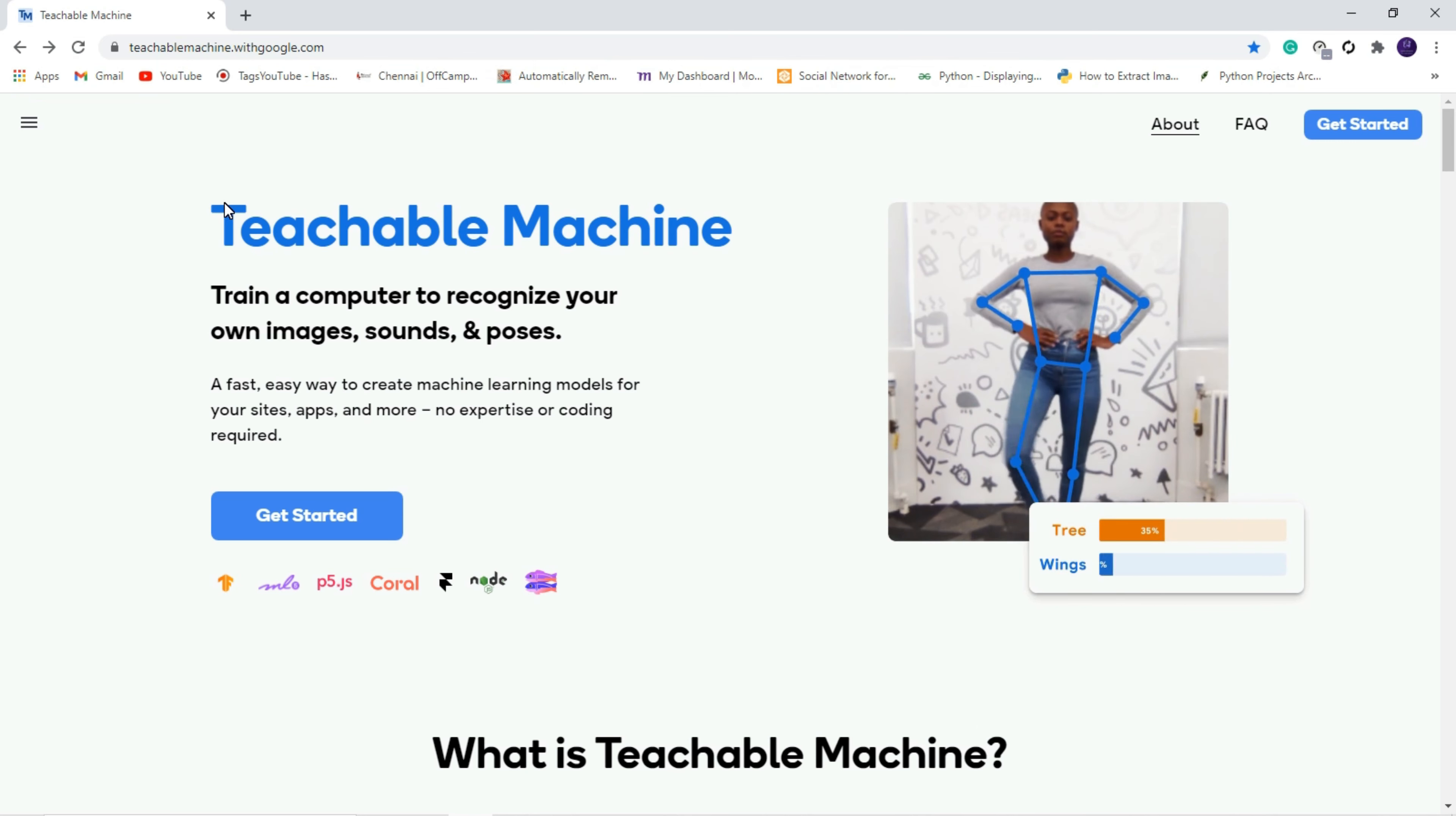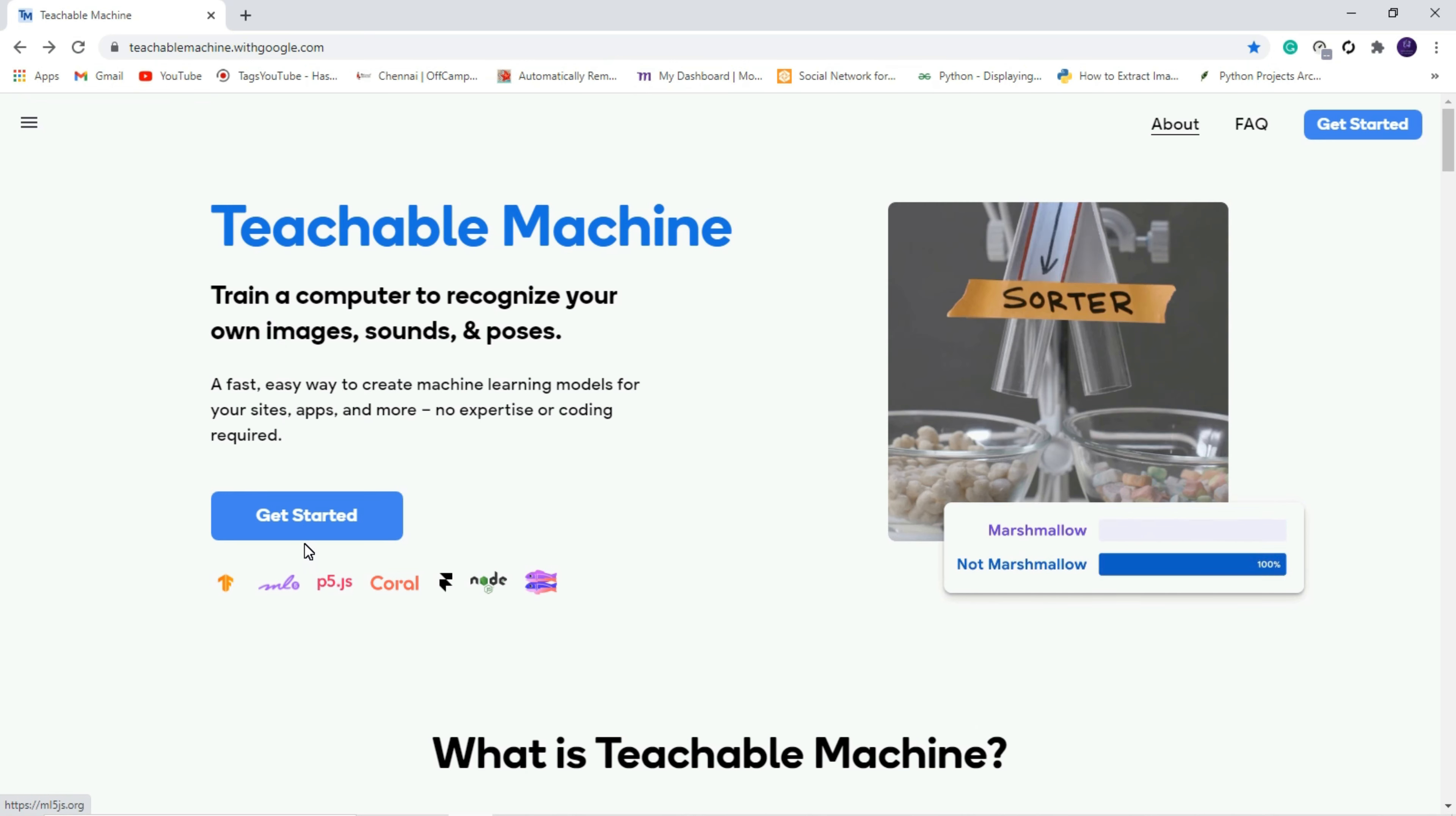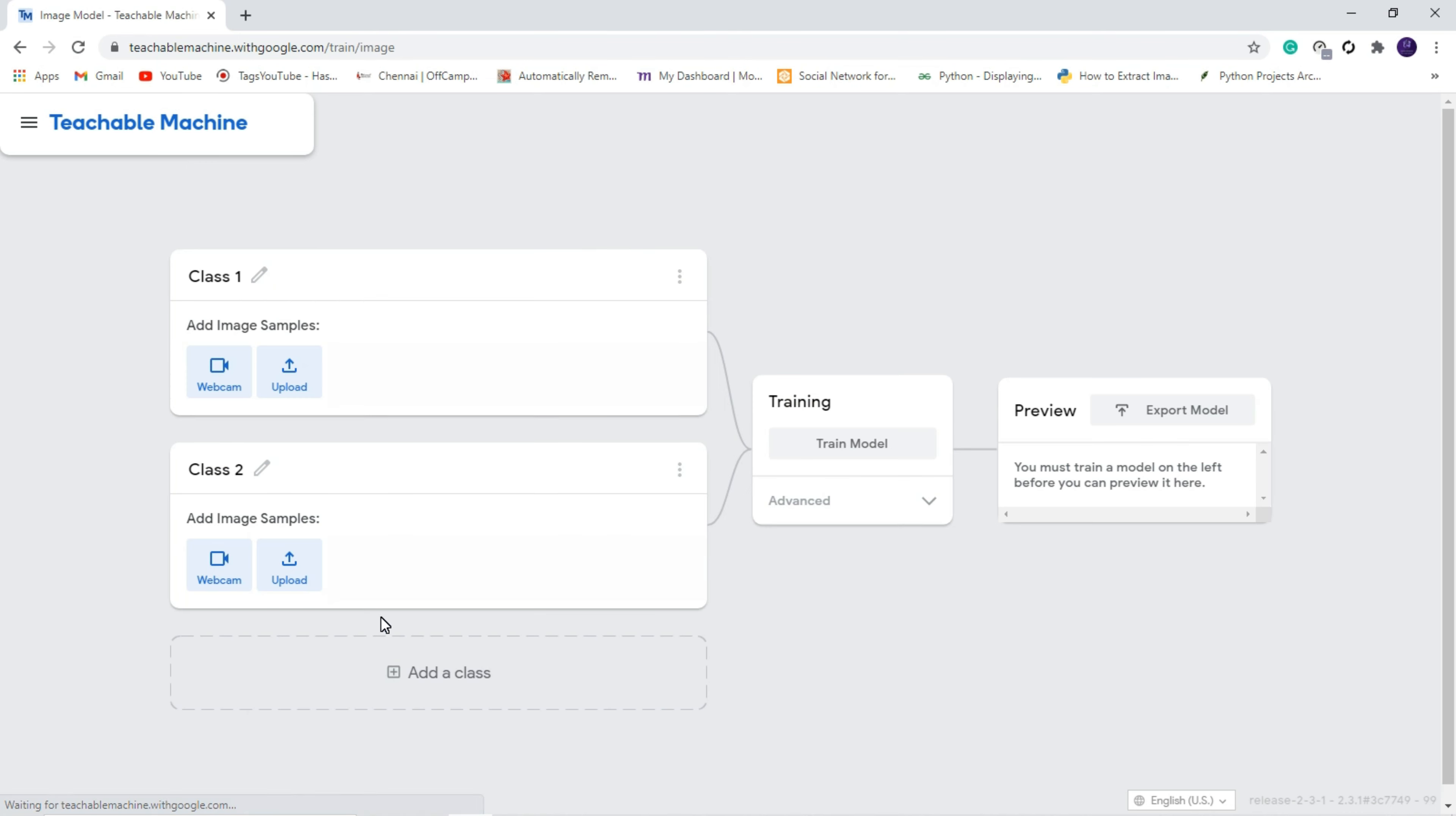If you are not having much programming knowledge in Python and machine learning, you can use this website to create your very own machine learning model. Let us get started. Here you can do three projects: the first one is image project, audio project, and the pose project. We are going to do image project. After clicking that we have two classes. I am going to rename that as COVID and non-COVID.